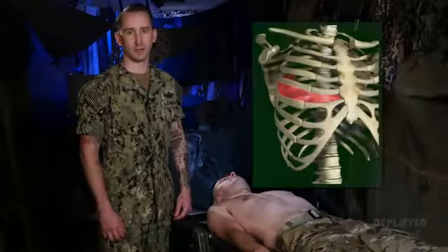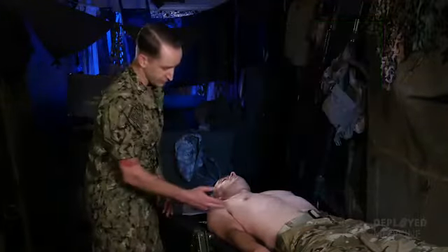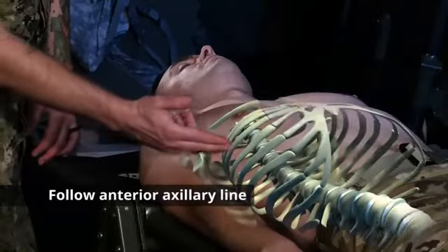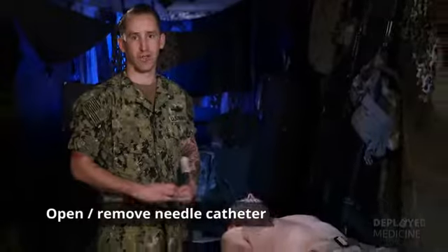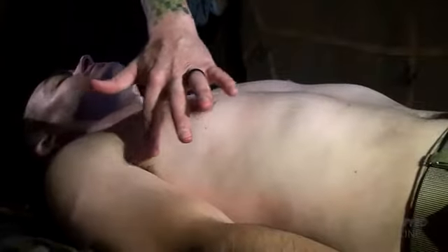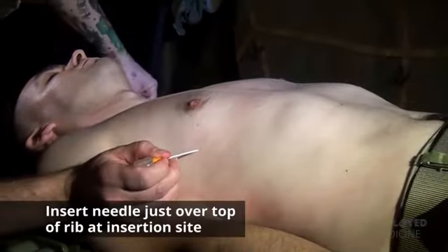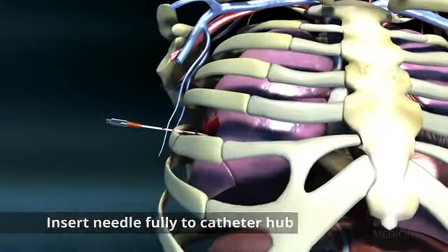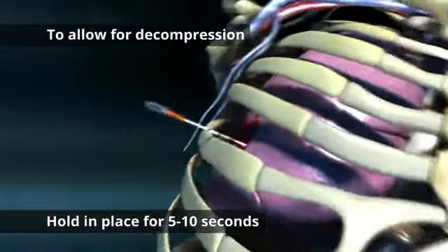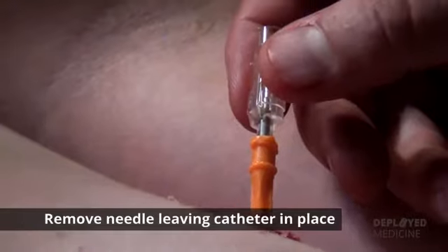The lateral site is located in the 5th intercostal space, anterior axillary line. To locate it, you're going to follow the patient's anterior axillary line to just lateral and below the nipple. Once you've identified the site, take your 10 or 14 gauge 3 1/4 inch needle catheter and begin your insertion. Following the anterior axillary line, I'm going to insert my needle just over the top of the lower rib at the insertion site. Insert the needle catheter unit all the way to the hub and hold it in place for 5 to 10 seconds to allow decompression to occur. After the NDC has been performed, then remove the needle, leaving the catheter in place.